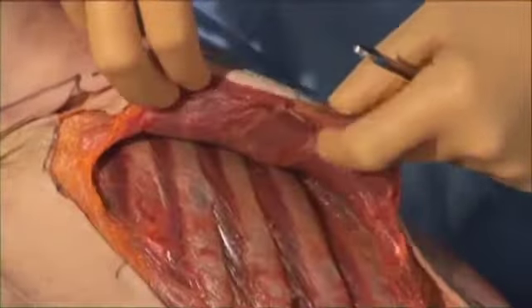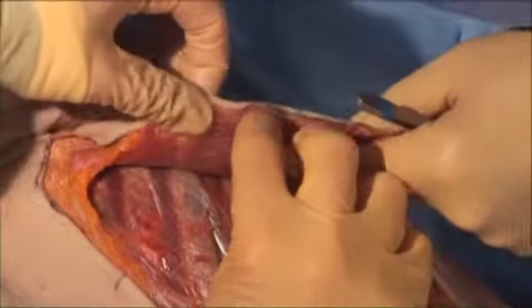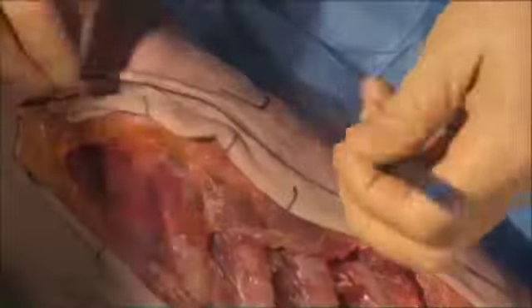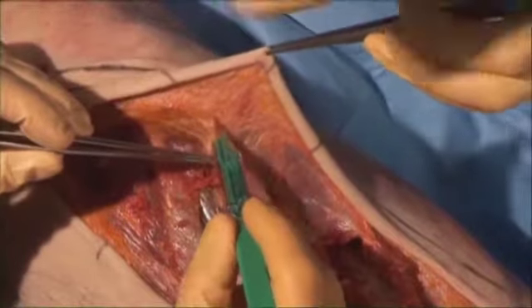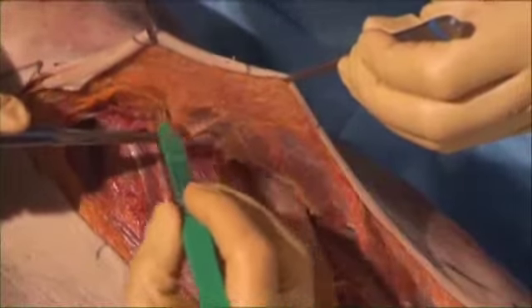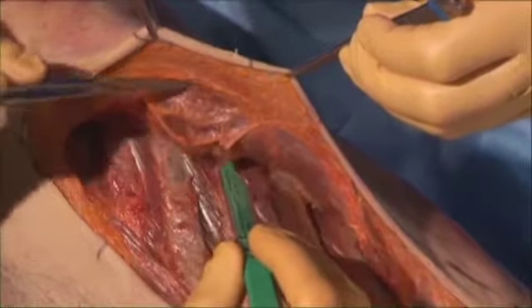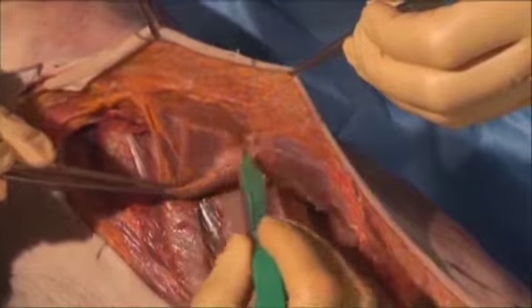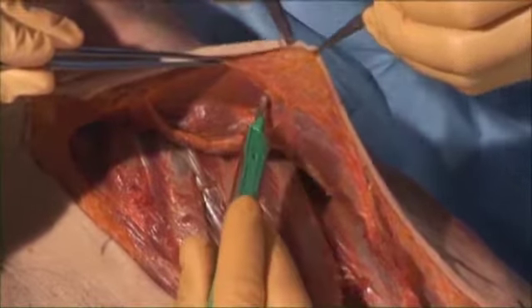Once you've got the serratus lifted, which can be a little bit of work, the nice thing is now the serratus is still connected to the latissimus. It's probably a good thing to show that. Just lift that skin flap up there. And then forceps. Lift it in the way that I want. There you go. And here's the edge of the latissimus here, and here's serratus.